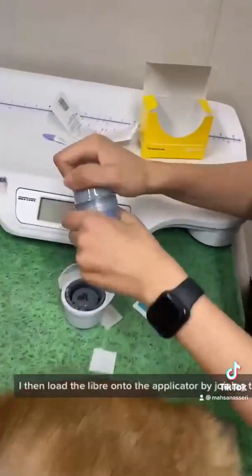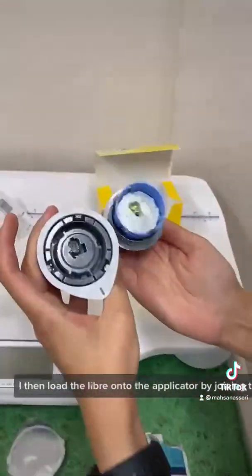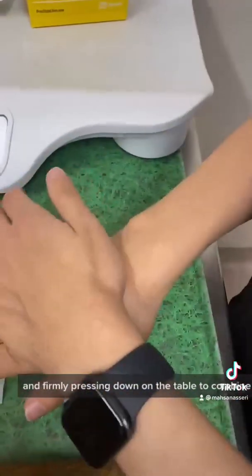I then load the Libre onto the applicator by joining the two pieces together and firmly pressing down on the table to combine them.